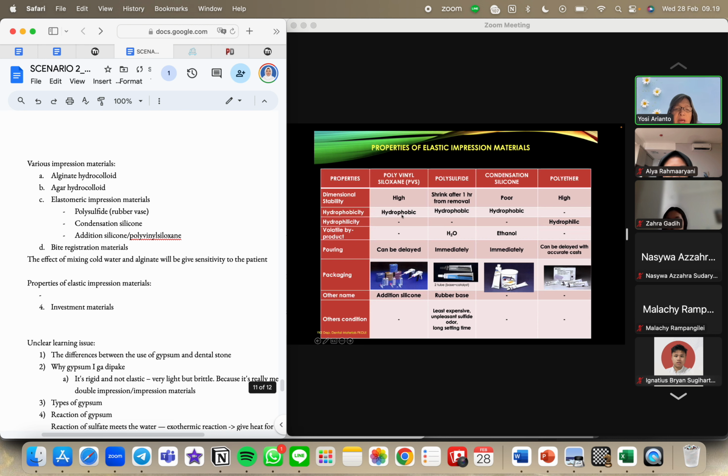It is hydrophobic, and because of that, pouring the gypsum into the impression can also be delayed. You can delay it. Maybe one day is okay, and the accuracy is still very good. It is also called the addition silicone. Now, dentists usually like this addition silicone or PVS.